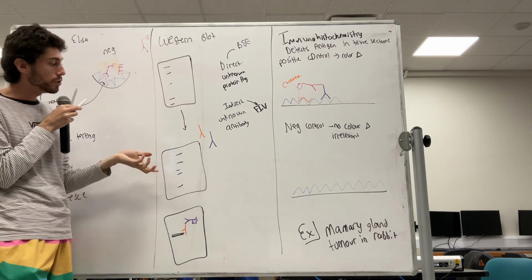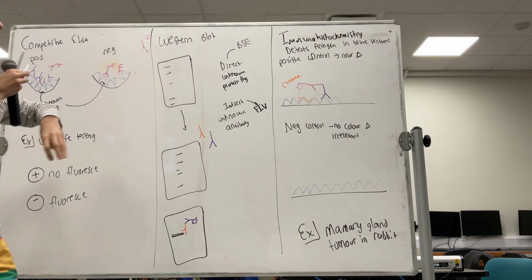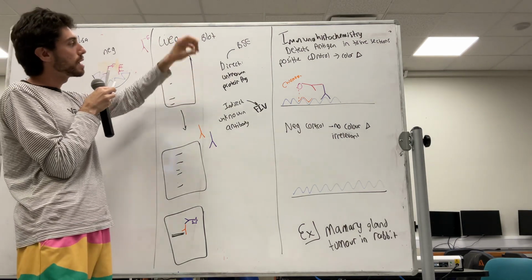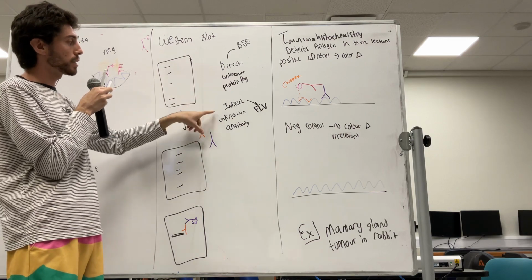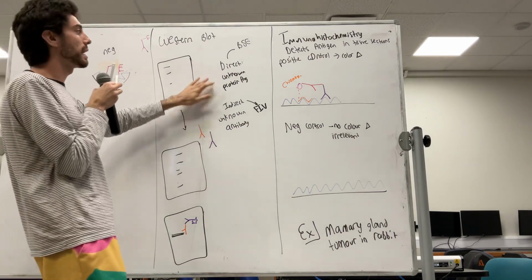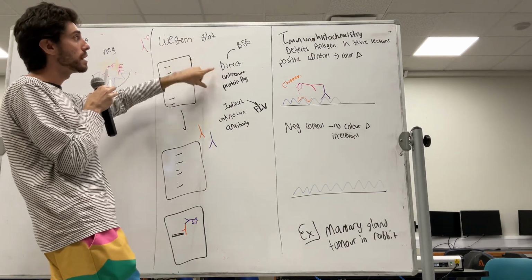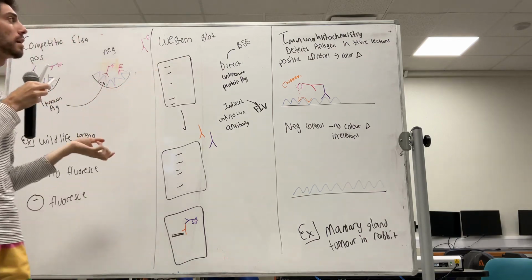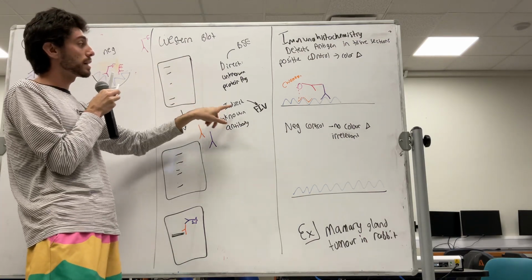And then, depending on if we're doing a direct or an indirect Western blot, direct would be you have an unknown protein antigen, and indirect would be you have an unknown antibody. So those are what we're trying to detect. The example for the direct, which is the only one that we could find, is for bovine, I think it's spongioencephalopathy, and the indirect is for FIV.